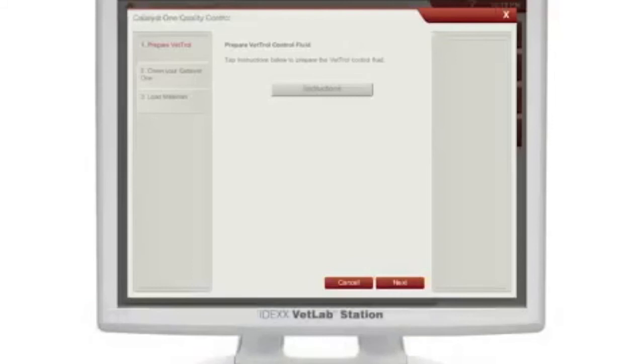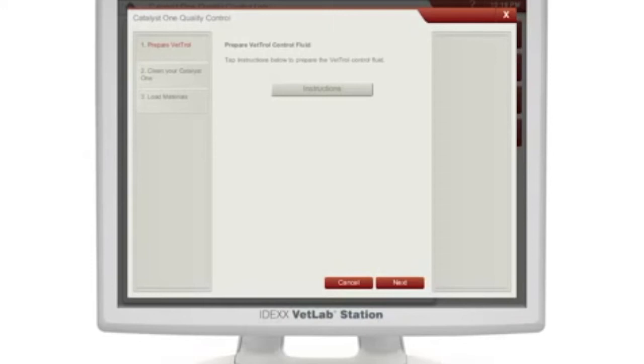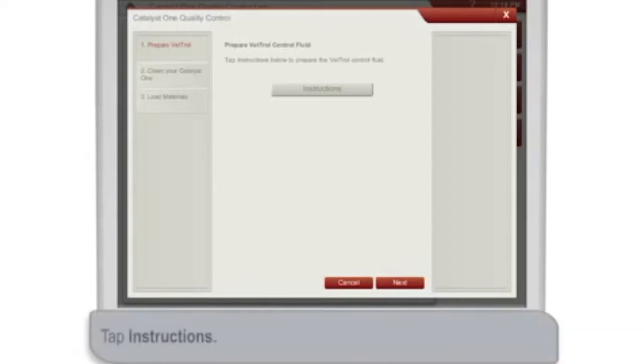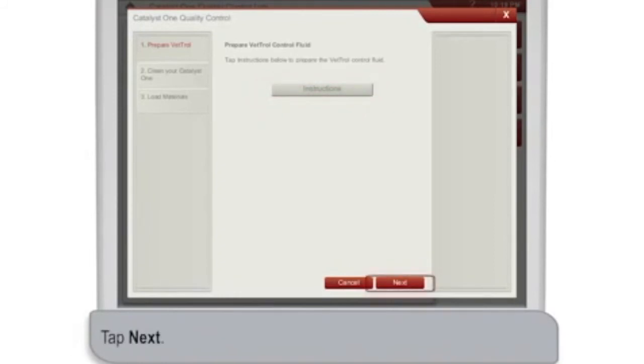If you'd like to view on-screen step-by-step instructions on how to prepare your control fluid, how to clean your analyzer, or how to load materials in the sample drawer, tap Instructions. Otherwise, tap Next to move forward.